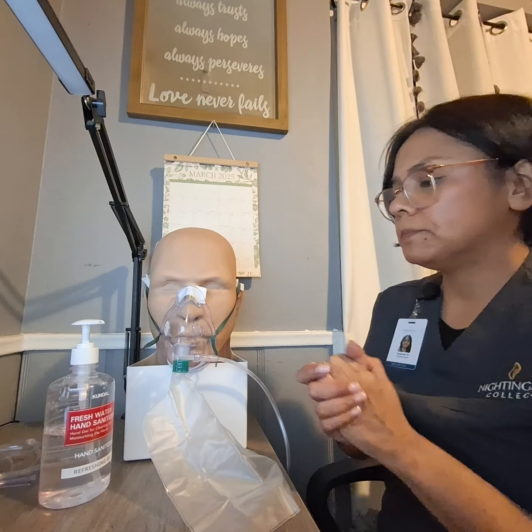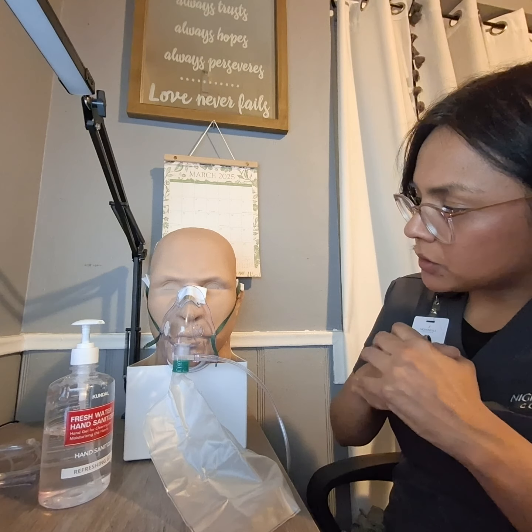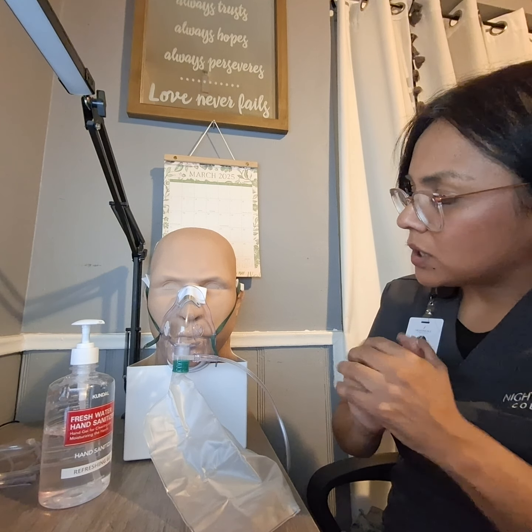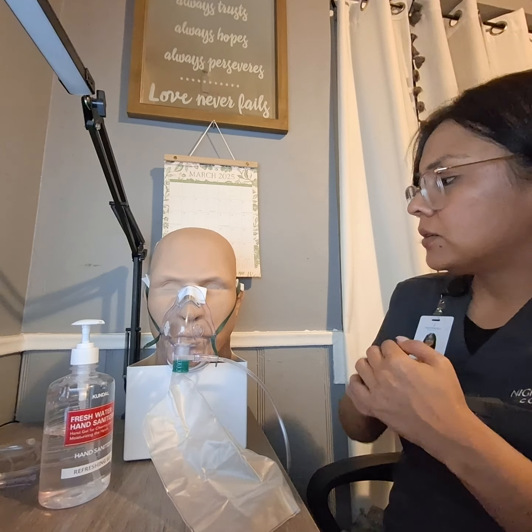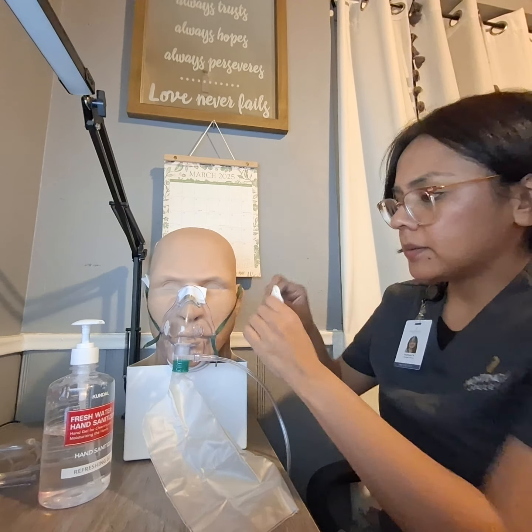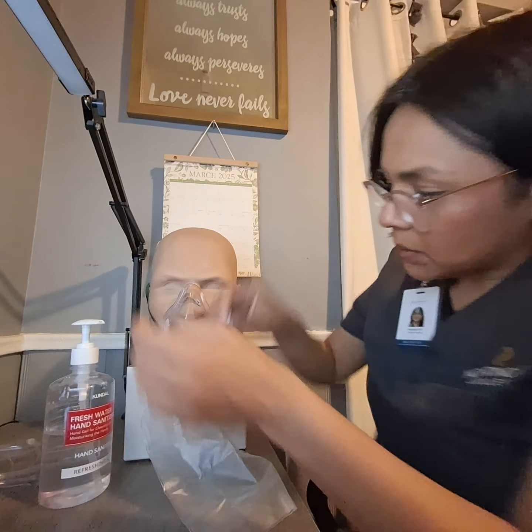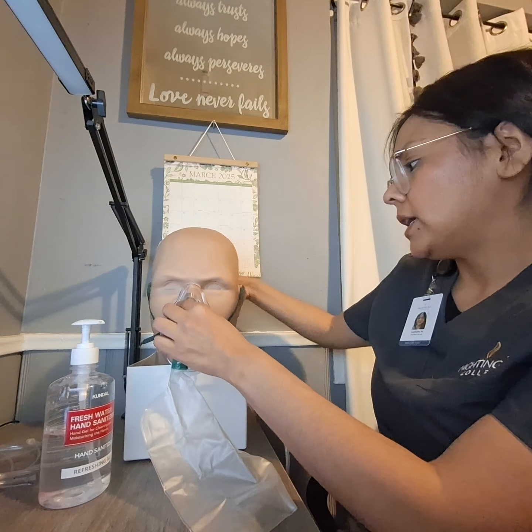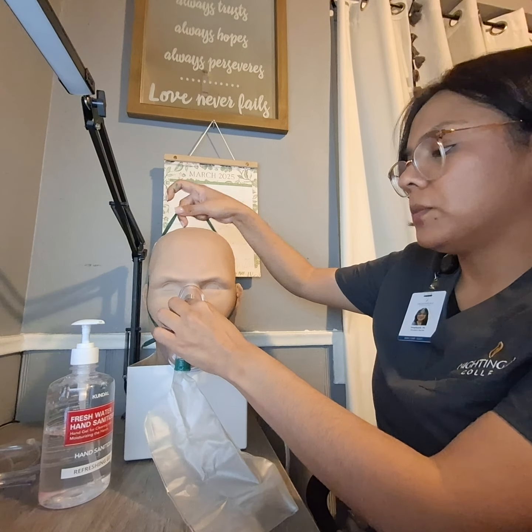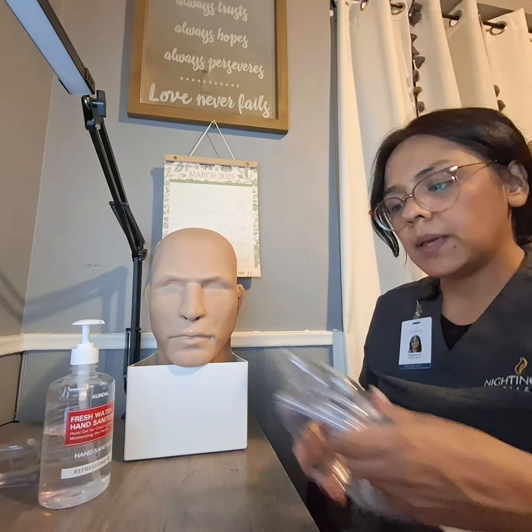All right, so I walk back into the room, close the door behind me to ensure patient privacy, perform hand hygiene. All right, Mrs. Garcia, so your oxygen is back to normal and the doctor has put in an order for me to remove your mask. All right, so I will go ahead and remove the gauze pads. I will turn off the flow meter here on the wall. I will remove your mask and discard the mask.